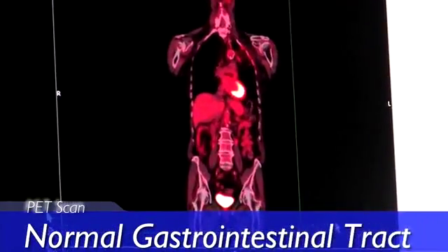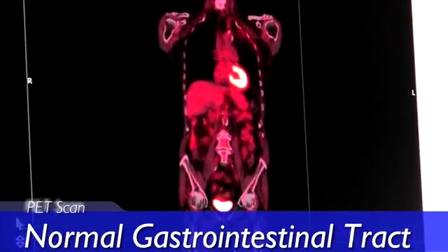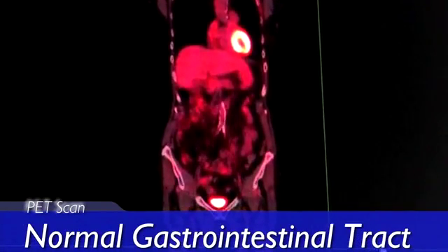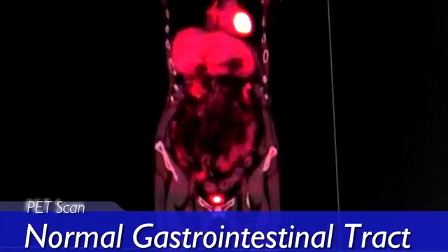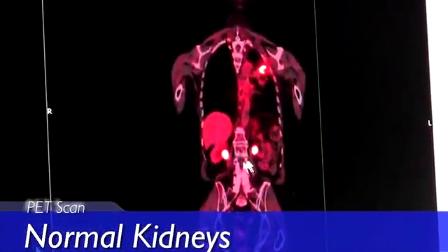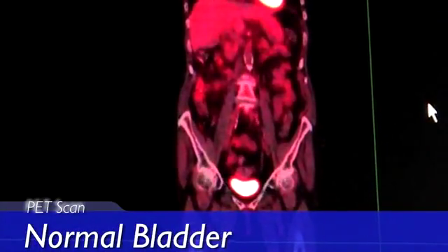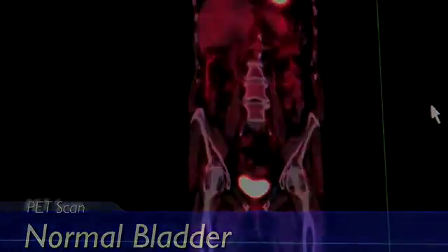The gastrointestinal system always has a little bit of muscular activity secondary to just the normal muscular squeezing of the GI tract, the peristalsis. So various parts of the colon show up. The PET scan is not ideal at looking for colon malignancies, but it can see something if it is large enough. The collecting system of the kidney would glow brightly on the PET scan, and often you can trace the entire ureter down to the bladder, which would also glow very brightly in most cases because of the collection of the excess radioactive tagged glucose there.